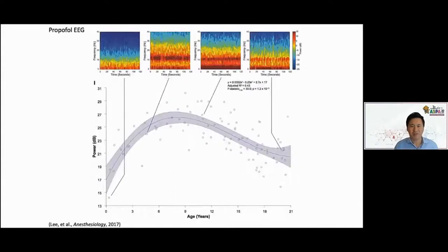So I think the strategy we take away from that is that in children that have an alpha oscillation, you could start to see it as early as 6 months of age, but more reliably maybe around 8 months of age. We can use that alpha wave and changes in that to more precisely titrate the anesthetic concentration. Dr. Bong will be showing you many examples of that. I'll show you a few also here. But that would be the strategy for the children that have the alpha wave. Basically, use the same rules as adults, because even though the power is different, the pattern is very similar to that in adults.